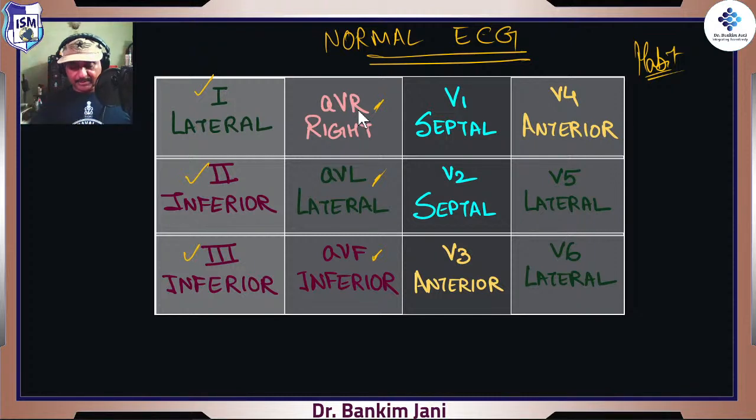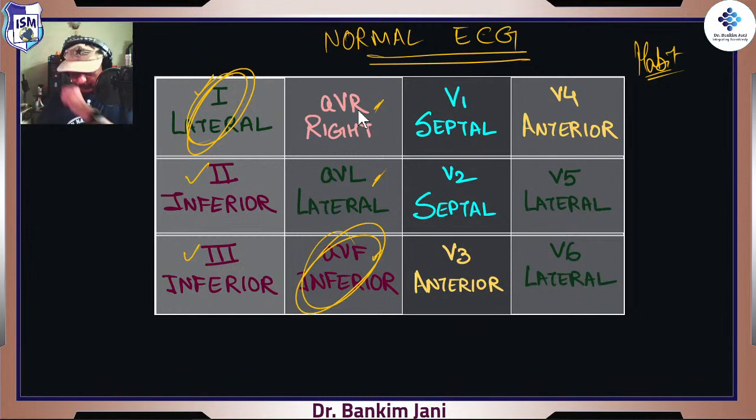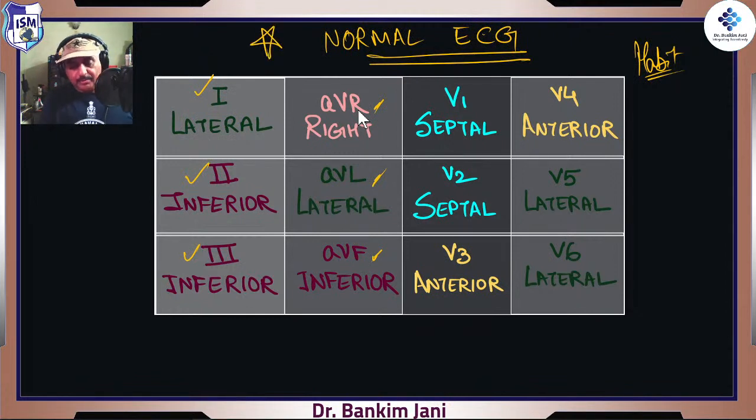So the first thing, the moment you want to see what the axis of the heart is, instantly your eyes would fall on this and this. You will say, okay, this is plus, the heart is not rotated. Within seconds, you will say, okay, the heart is not normal. You will say this heart is left rotated, right rotated. And from the condition, you will say that this patient is having right ventricular hypertrophy or left ventricular hypertrophy. It's like within 10 seconds, you will start speaking as if that ECG is talking to you, right? So this is one very important figure, right?